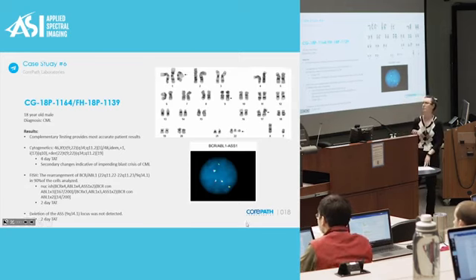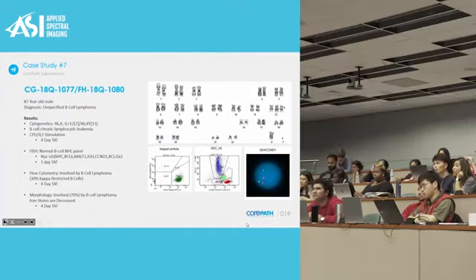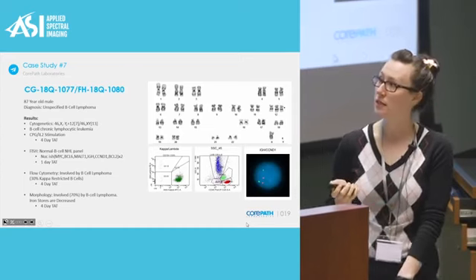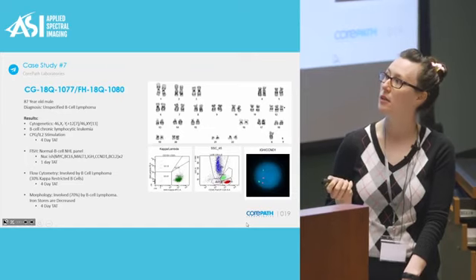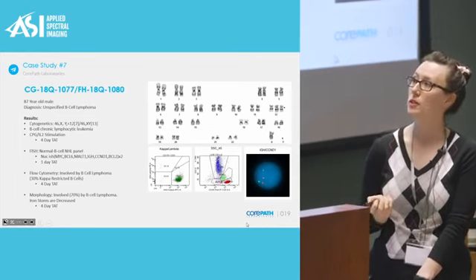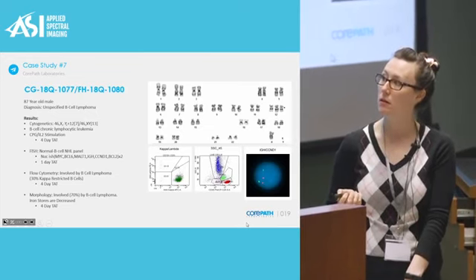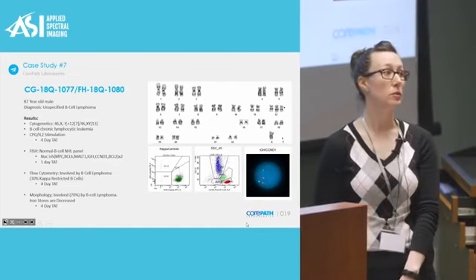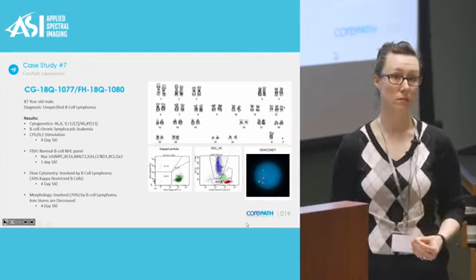And lastly, I have one more. I know we all like looking at chromosomes and FISH early in the morning. I have an 87-year-old male with a diagnosis of unspecified B-cell lymphoma. Cytogenetics released results in 4 days with the results of -Y and trisomy 12. Pretty straightforward, right? And for cytogenetics, due to the indication of the B-cell lymphoma, we stimulated one of our cultures with CpG-IL2. If the diagnosis indicates, we will stimulate using CpG-IL2 to ensure that we are looking at the proper cells.